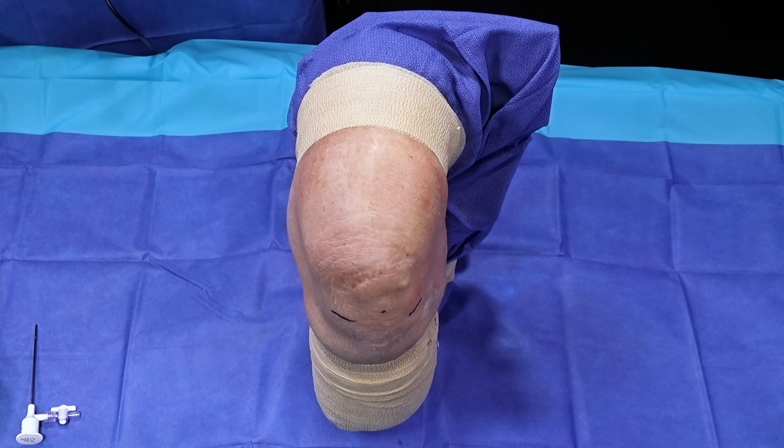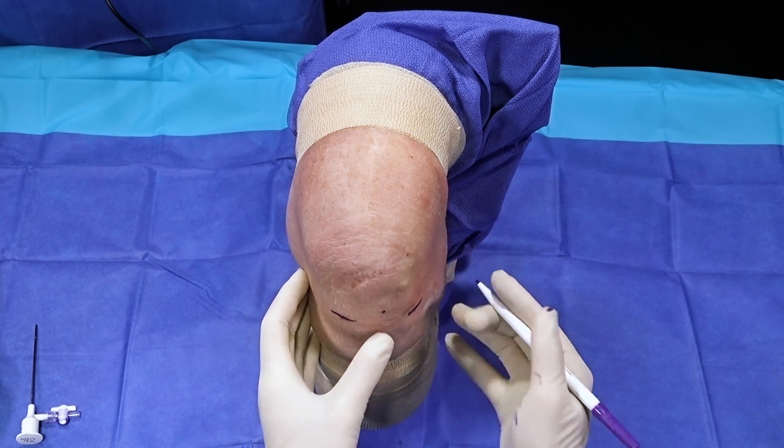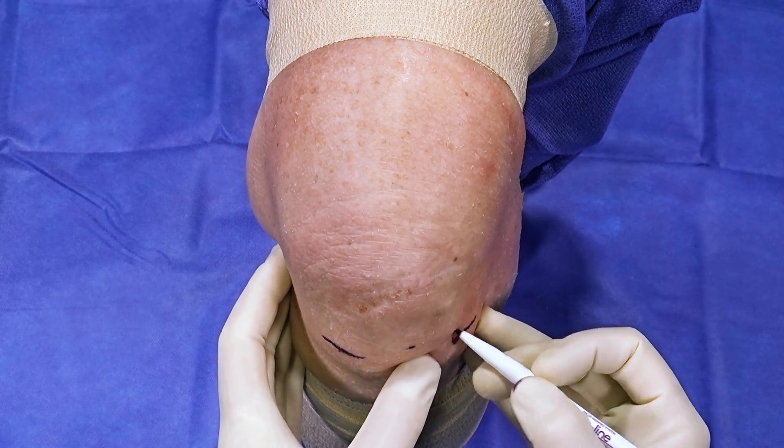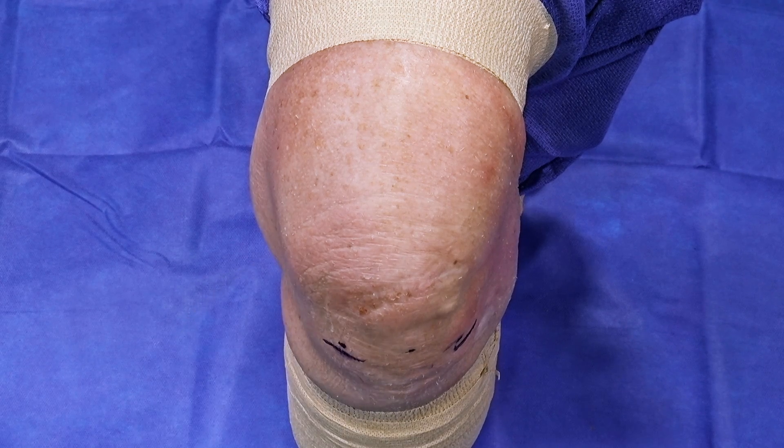I've found that, especially when the patient is awake, it is very important to understand where your surface landmarks are, as that will increase your efficiency during the procedure and improve the patient's comfort. Traditionally, the arthroscopic portals are a little different. We go right above the joint line, slightly one centimeter away from the patella tendon on the lateral side. And on the medial side, you want to be just above the joint line as well. This will allow for easier access to the traditionally hard to reach areas within the knee.